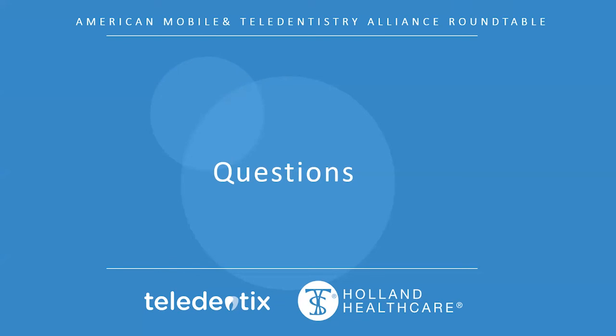So it looks like we have time for one more question. McAllister, I know you put one in there, and I think this is probably geared towards Dr. Simpson's expertise. When you show an intraoral photo to a patient, does that make them more accepting of the treatment? Does it give them a sense of urgency? Do they understand a little bit more of what you're seeing in the mouth?